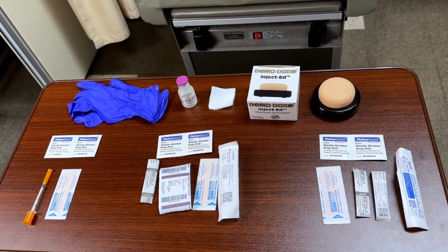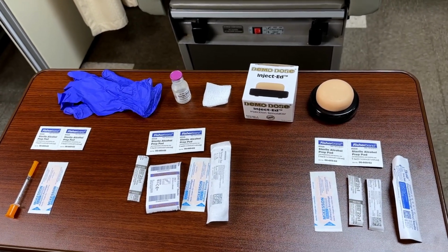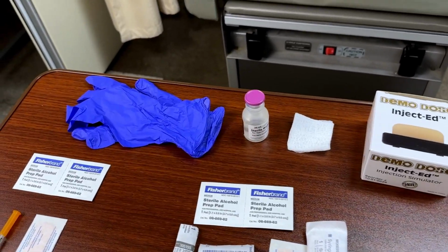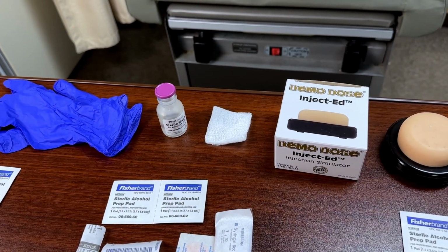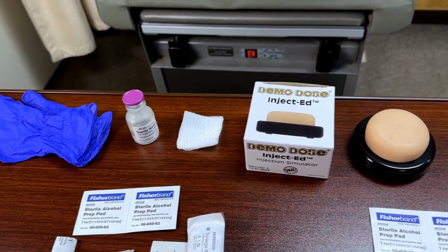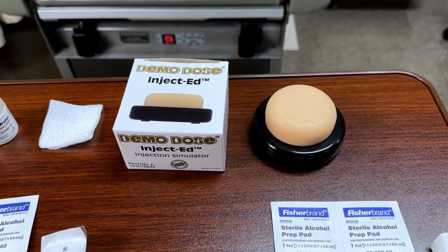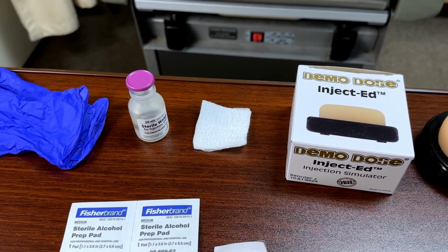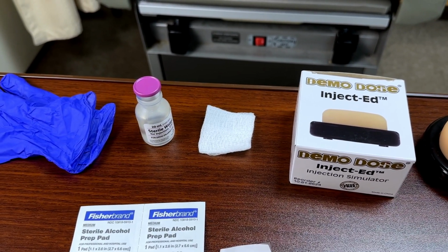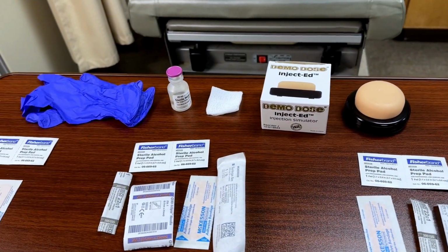All right, next let's take a look at the different supplies that we'll be needing to do these procedures. So we'll need some non-sterile gloves. Make sure you know what size you are. We'll need our medication. In this case, we'll be using sterile water. We'll need our Inject Ed demo dose to use as the patient. Also might want to have some little 2x2 gauze to have in case we need it. Then we're going to need different sets of instruments for each type of injection.